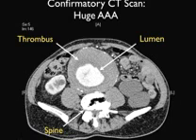Now, fortunately, this CAT scan confirms the lack of rupture of this very large AAA, but just recall the caveat that in a patient who has unstable vital signs and a very large AAA is found on bedside sonography, delaying for a CAT scan can be the difference between saving the patient and death.